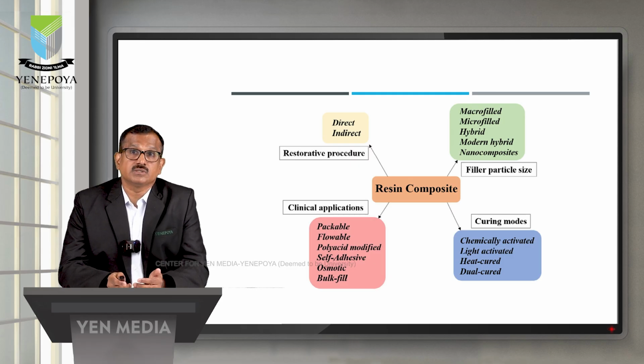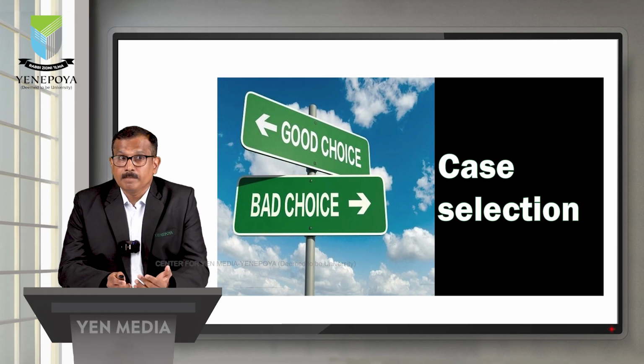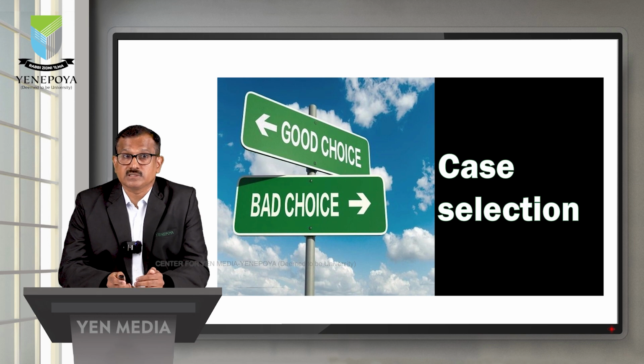So let's focus on how case selection can be done. After understanding these materials, before we go into the clinical aspects, always remember every clinical case is different; it differs from patient to patient and has different kinds of applications. So one should understand what the right case is. Composites are considered to be somewhat technique sensitive because they need 100% isolation during the procedure.